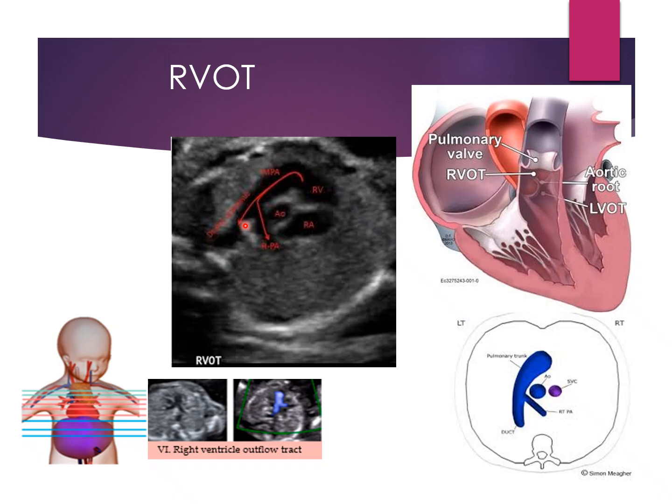But the one thing that I want to point out that we're missing in this image is our right ventricle. We want to include that right ventricle along with the right pulmonary artery, the main pulmonary artery, the aorta and the right atrium. So this is the image that you are going to see.